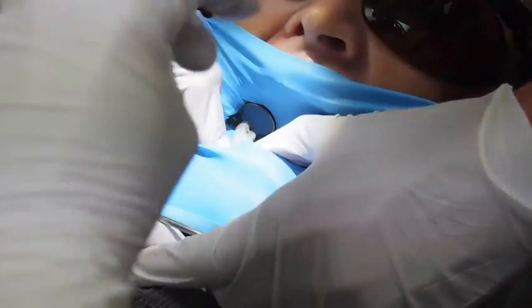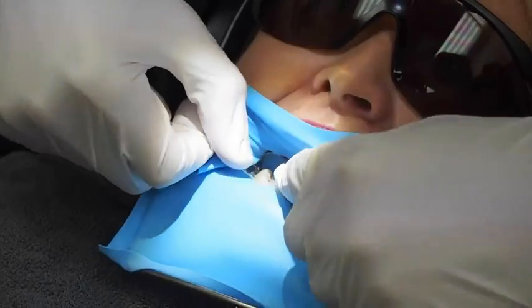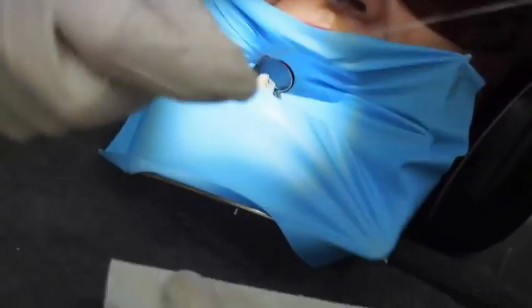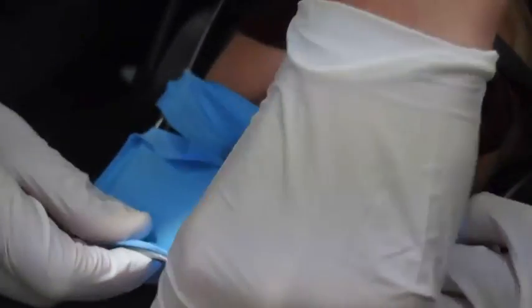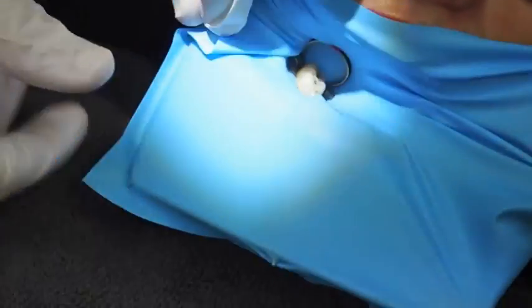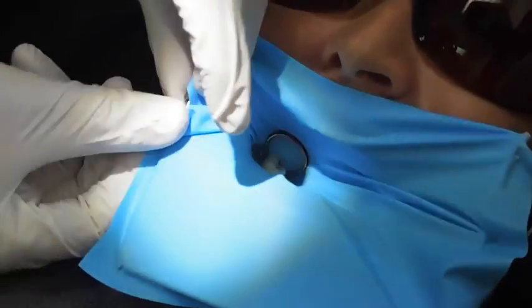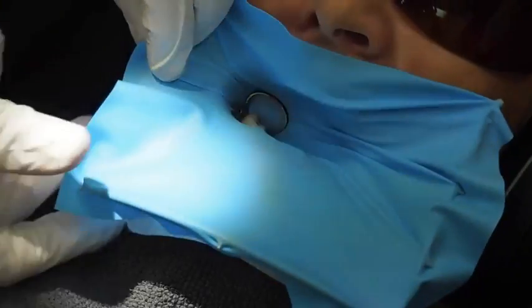If you've got a skilled assistant they will then floss the rest of the contacts. Quite often once the first one is done I will take over and floss the rest of the contacts — it's just easier from where I sit behind the patient. Quite often the rubber dam is quite tight behind the clamp and you need to push the rubber dam down behind the clamp, just so that there's not a gap on the very distal of the back tooth.